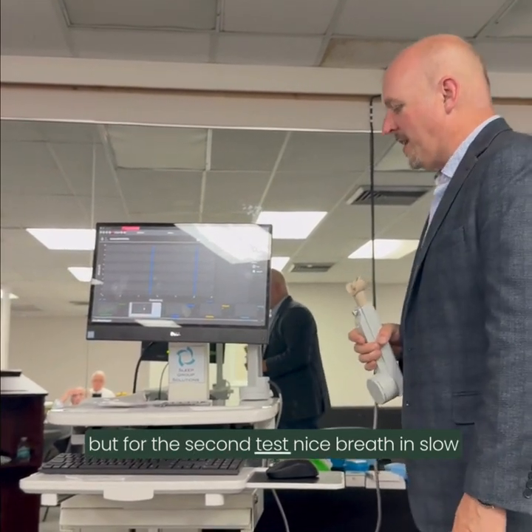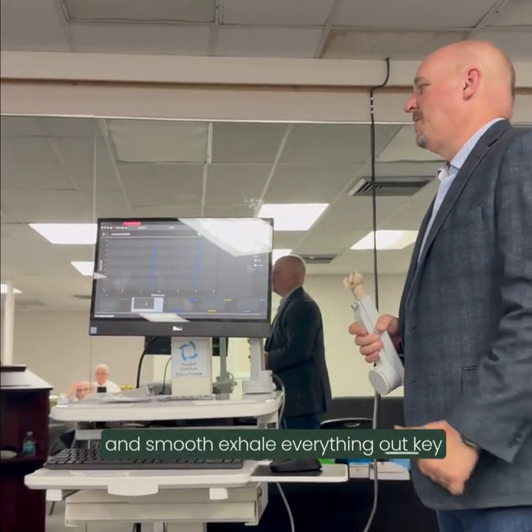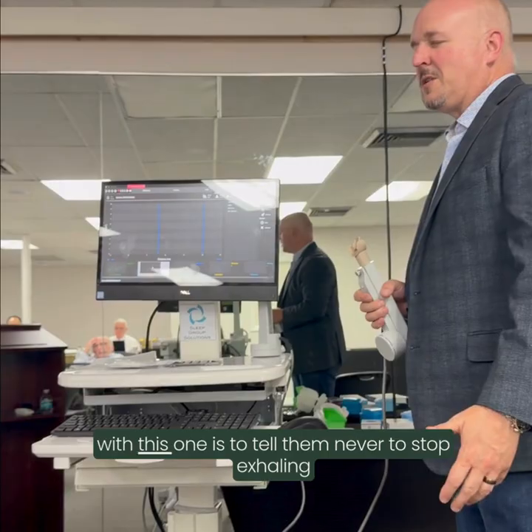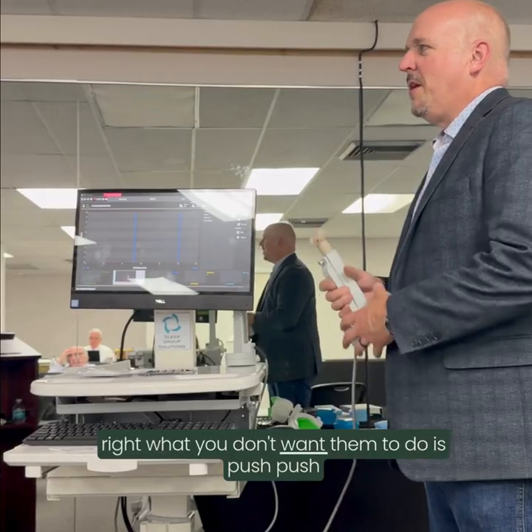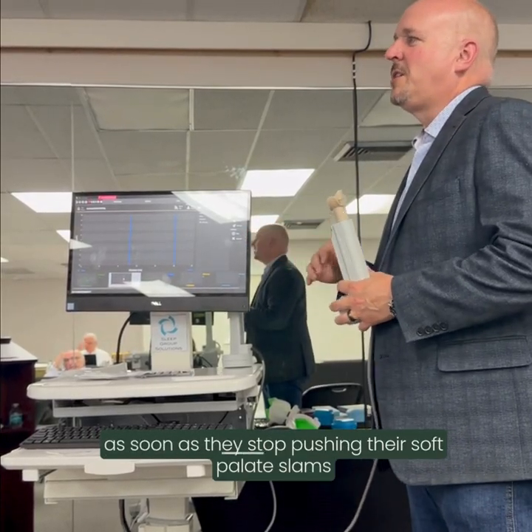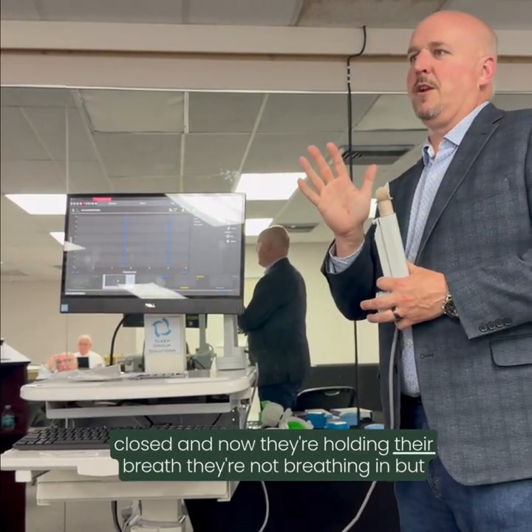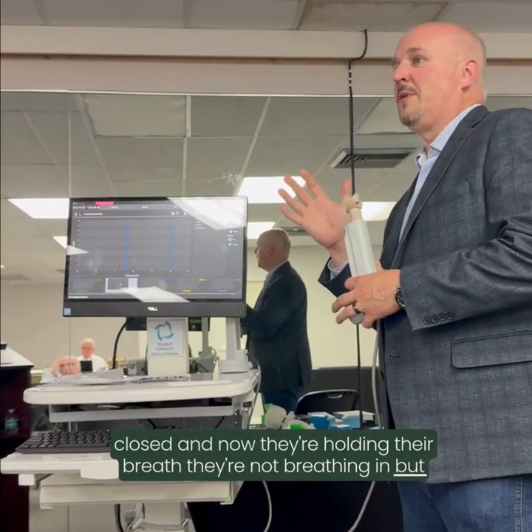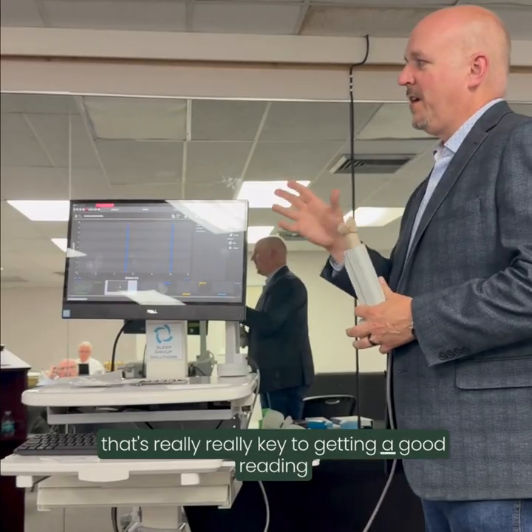But for the second test, nice breath in, slow and smooth, exhale everything out. The key with this one is to tell them never to stop exhaling, right? What you don't want them to do is push, and then pause. Because as soon as they stop pushing, their soft palate slams closed, and now they're holding their breath. They're not breathing in, but they've stopped breathing out. And that's really, really key to getting a good reading with this.